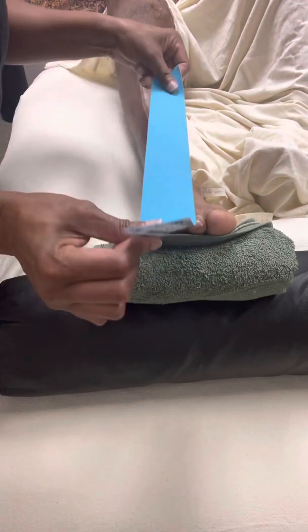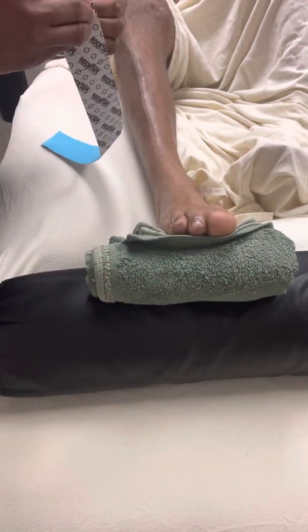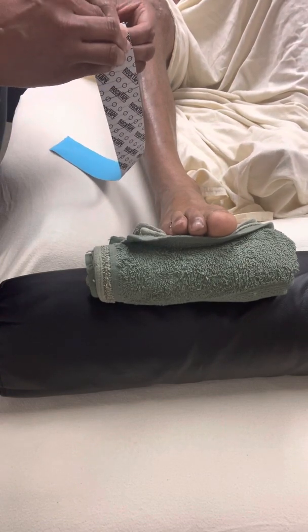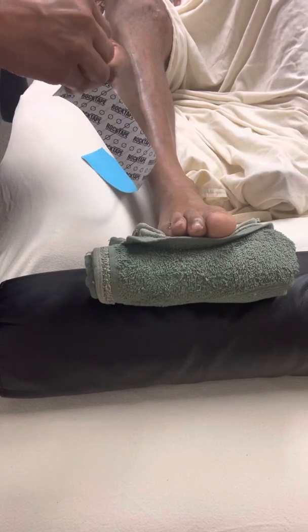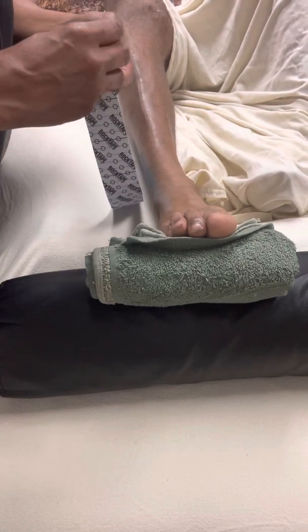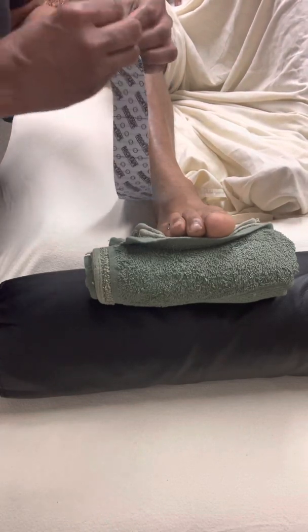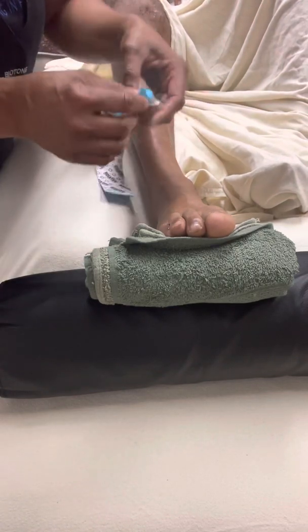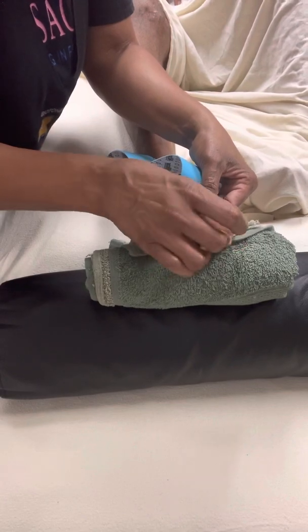I already pre-cut my tape here, my kinesiology tape. So I'm going to take and peel it back a little bit, cut a little paper here. Now I'm going to take and put it here on his big toe right here.